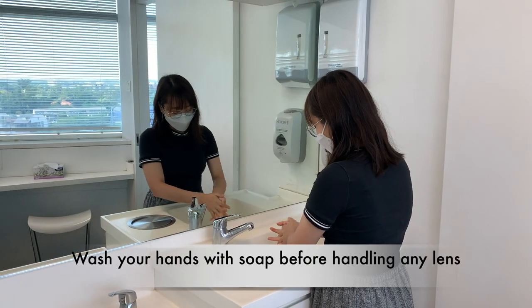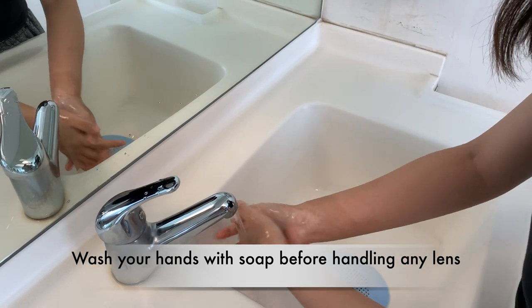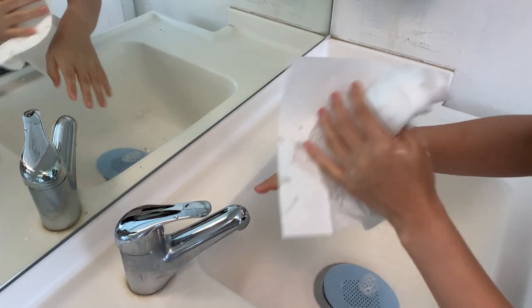Firstly, wash your hands with soap before handling any lenses. Hygiene is very important. Next, dry your hands with a lint-free paper towel. Make sure that they are completely dry.